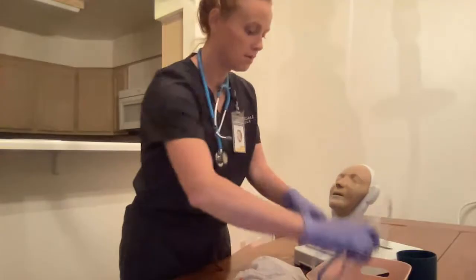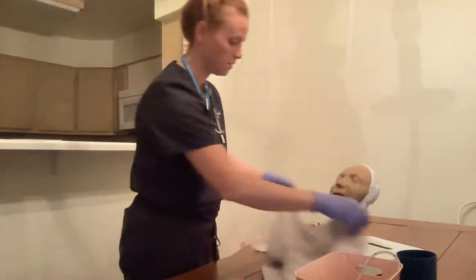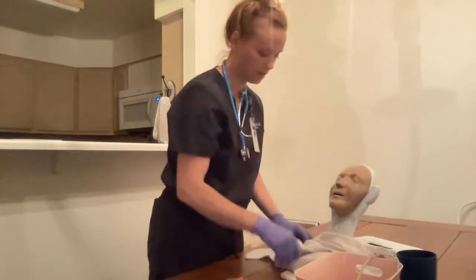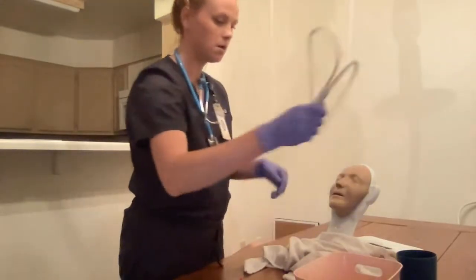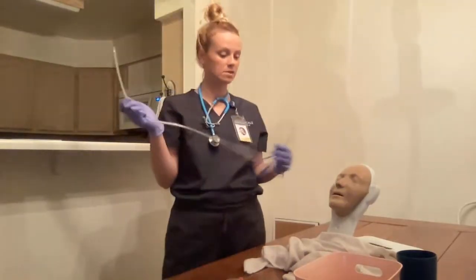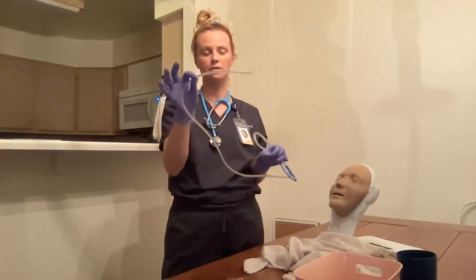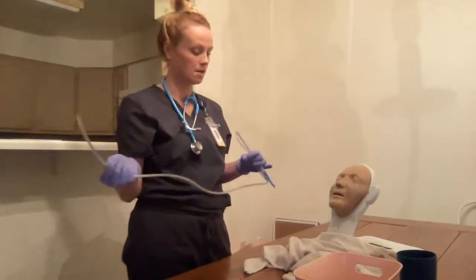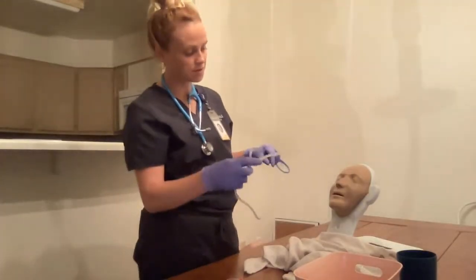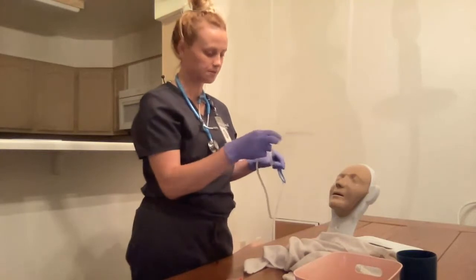Alright, Mrs. Smith, I'm going to place a towel around you. Just like that. Alright, next I'm going to get everything ready. When inserting the tubing, you want to insert at the natural curvature of the tubing. What I'm going to do is lubricate it, ask her to hyperextend her head, and then slide across the floor of the nostril towards the ear and towards the nasopharynx.